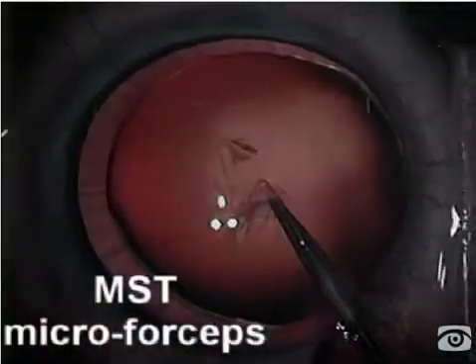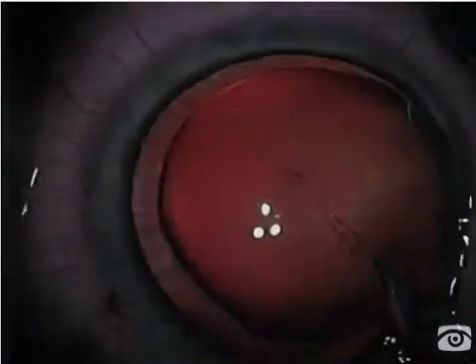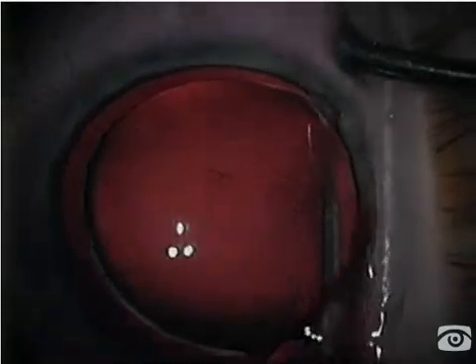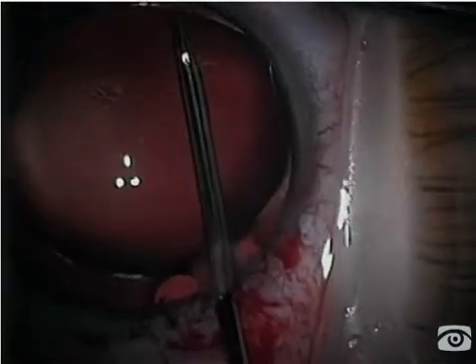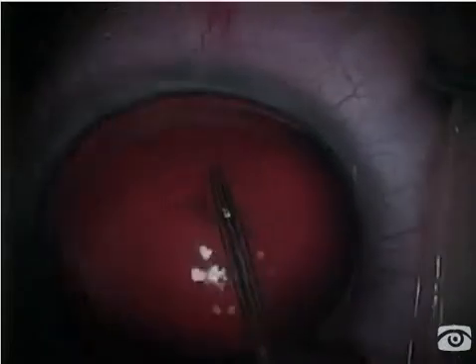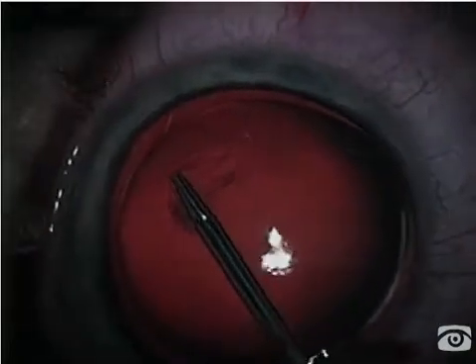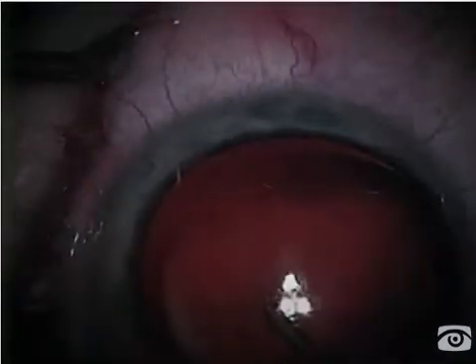I'm switching to micro forceps that I can use through a clear corneal stab incision. This is helpful for two reasons: the profile of the instrument is very small in the setting of a very shallow chamber, and I'm able to exert very sharply tangential vectors on this capsular flap so that I can control this tear.